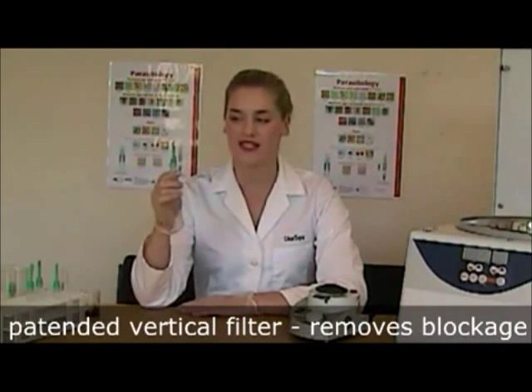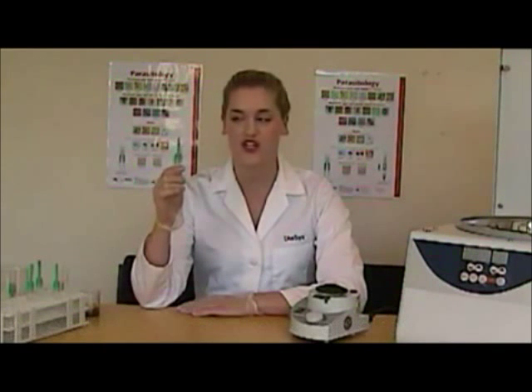The Paracep has a unique patented vertical filter which is designed to remove blockage. Due to the fact that the surface area is three to four times that of a flat filter, not only does it not block like a flat filter, but also you are left with the highest concentration of parasites in the sediment. It is a two stage filter whereby the outer filter blocks large faecal debris and the inner filter, 425 microns in size, allows the parasites through.